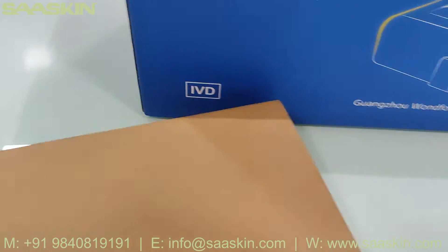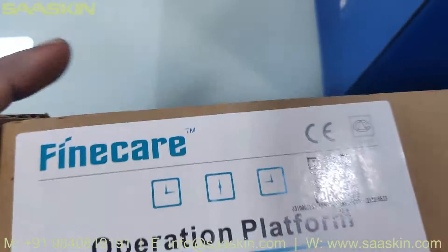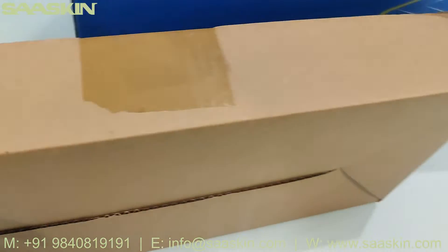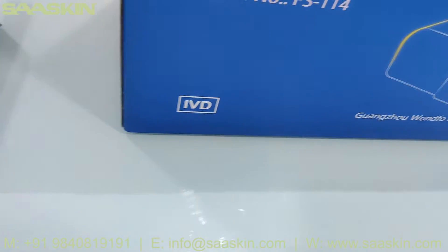Along with this machine, you get another box which says FineCare operation platform, which contains one platform kit and digital timer 5 kits. So I am going to open this one by one.